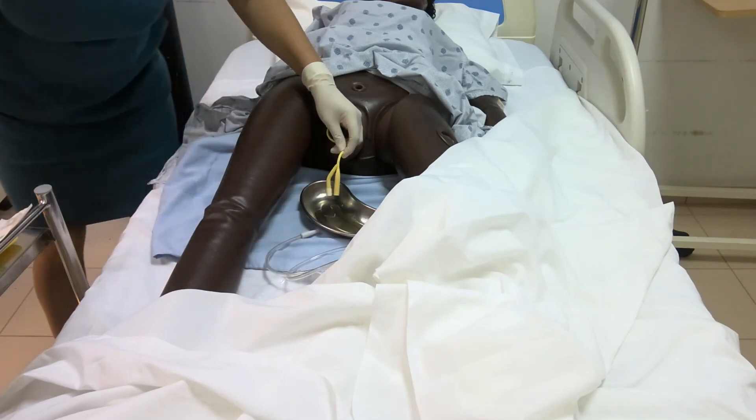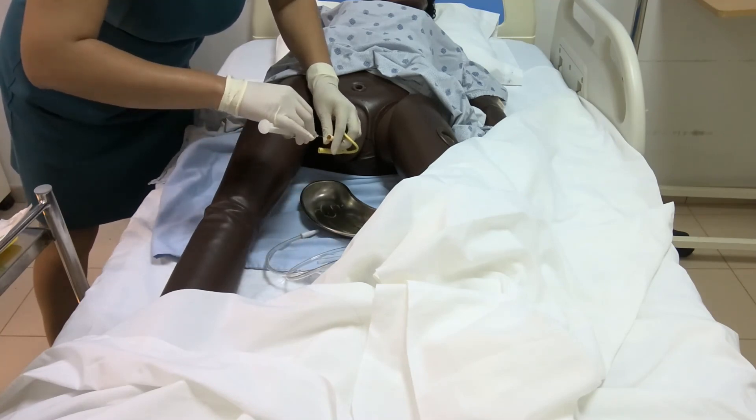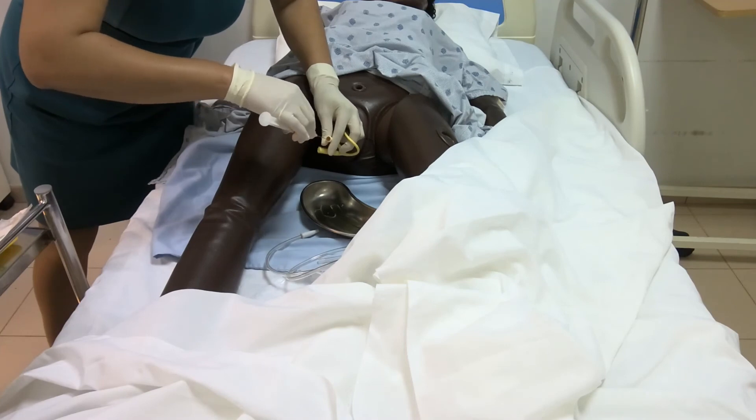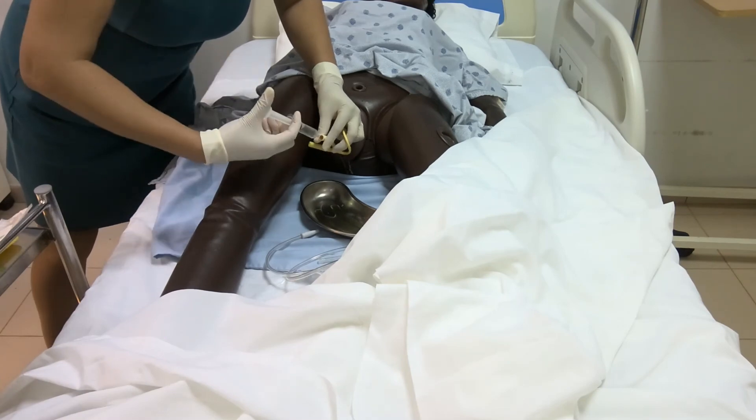For male patients, it is also common to introduce the catheter all the way to the Y-port. If you are gathering a specimen, the sample can be collected at this point. Be sure to avoid touching the container with the catheter to prevent contamination. Inflate the balloon and connect the drainage bag. It is suggested that you inflate the balloon before attaching the bag to prevent inadvertently withdrawing the catheter after you had just ensured placement with the presence of urine and the additional advancement. Using your sterile container also ensures sterility that is maintained until that system is closed.